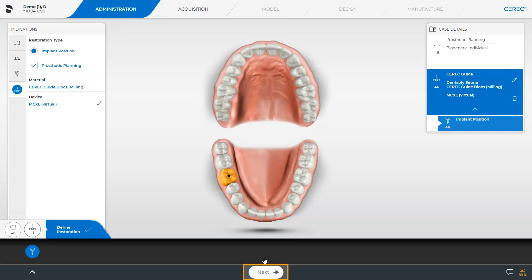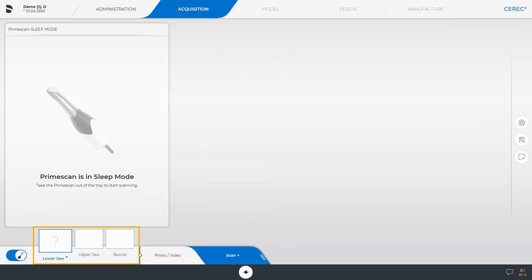We switch to the next phase: the acquisition phase. In this phase, we perform three scans. The image catalog for the lower jaw is a mandatory catalog, indicated by the question mark and the asterisk. The upper jaw and buccal image catalogs are optional. In order to obtain a functional position for the prosthetic planning for later implant planning, it is advantageous to also scan the opposing jaw and perform the buccal scan. In our case, we perform all three scans.